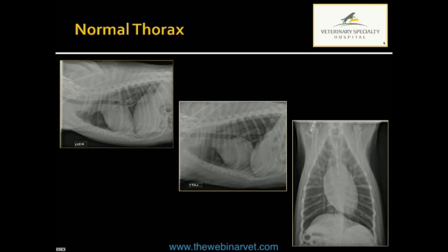That way you've made your assessment or conclusion on that particular organ system, rather than trying to interpret one view and go on to the next, which ends up being quite illogical and I think can confuse you in the end. So the first thing, you want to make sure your positioning and your radiographic technique is adequate. Certainly technique is much more simple with digital radiography, and we're not going to get into the nuances of technique right now in the interest of seeing more clinical cases here.